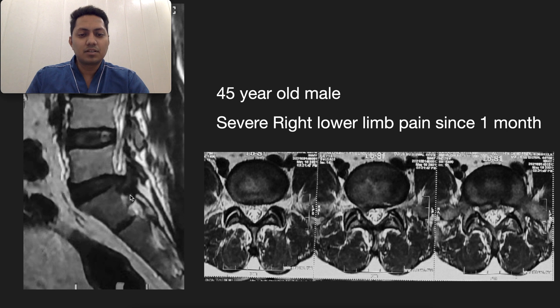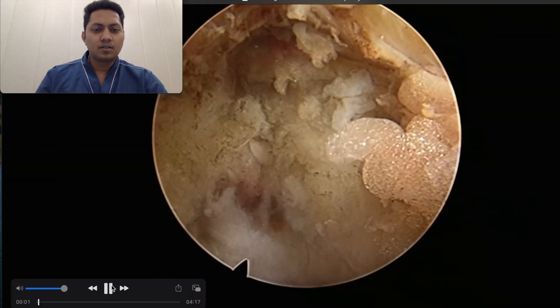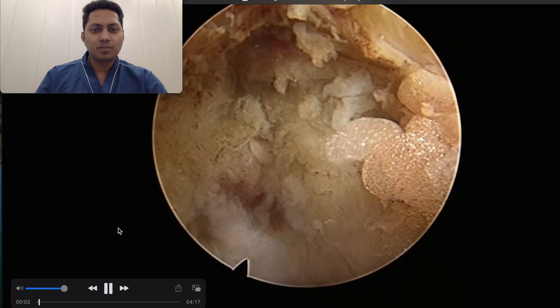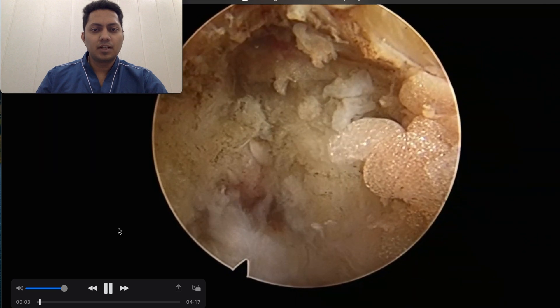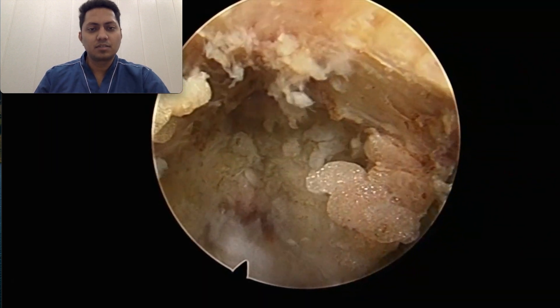So our target was to reach this area and to completely decompress our S1 nerve root to achieve good pain relief in this case. This is an endoscopic picture of the right L5S1 disc space.